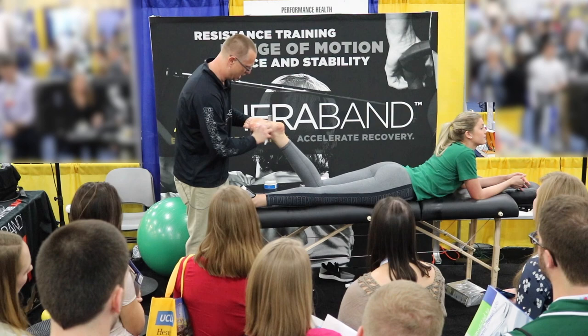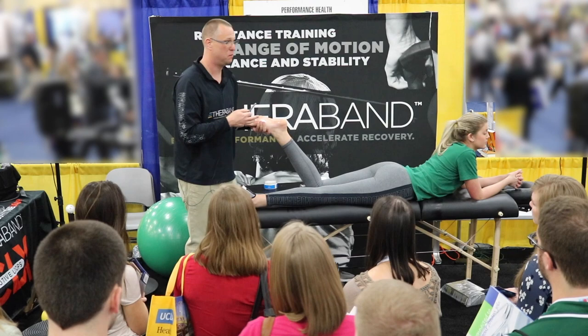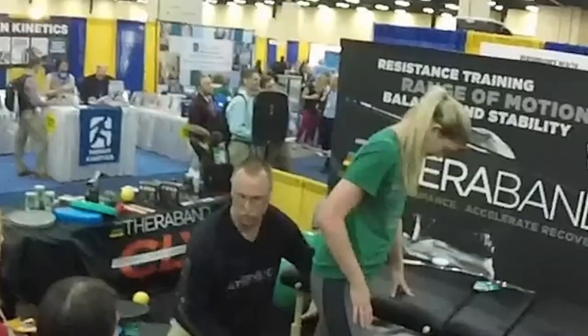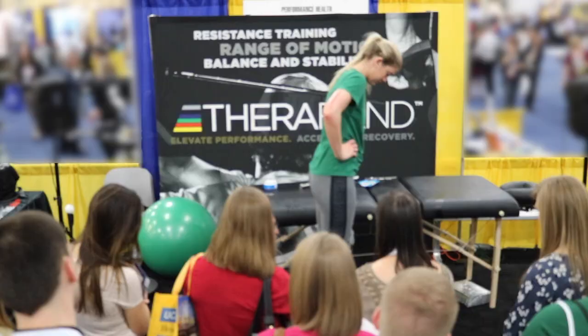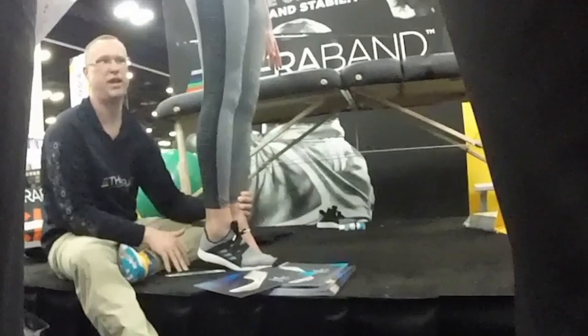Ultimately, I want to take the patient into the position of provocation — standing. I treat the kinetic chain: the calf, hamstrings, and Achilles tendon. Then my go-to move for the soft tissue is to have them do a simple heel raise. If they need to touch something for balance, that's fine. Now I have exposure to their weight-bearing loaded position of provocation.